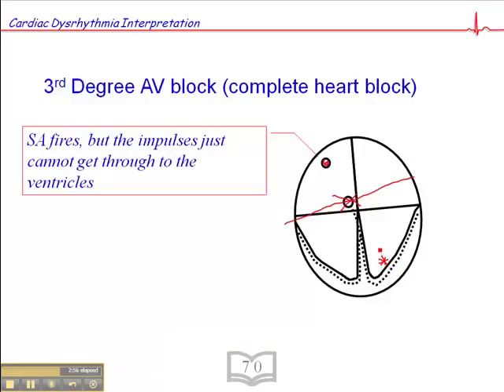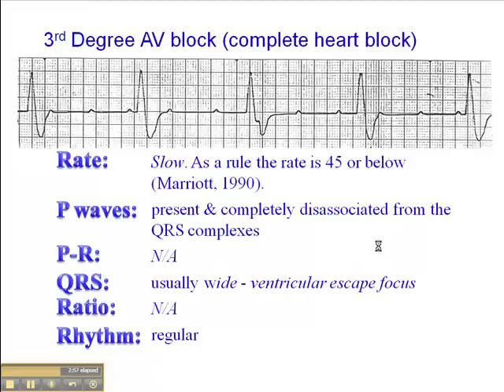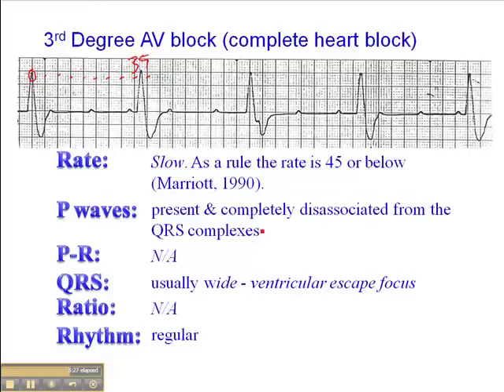If you look at the heart rate, it's quite slow, because a focus in the ventricle has an inherently slower firing rate. The Purkinje fibers have an inherent firing rate of between 20 and 40 beats per minute. Looking at the heart rate here — one QRS falls on a dark line, giving us 300, 150, 100, 75, 60, 50, 43, 37, 33 — so a heart rate of around 35 beats per minute in this case. A very slow heart rate.